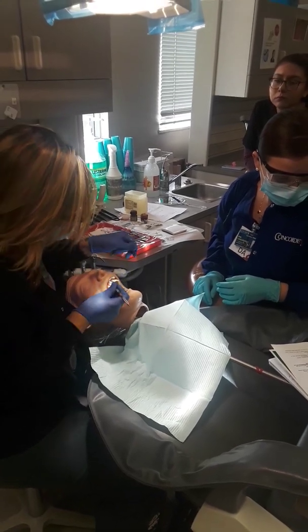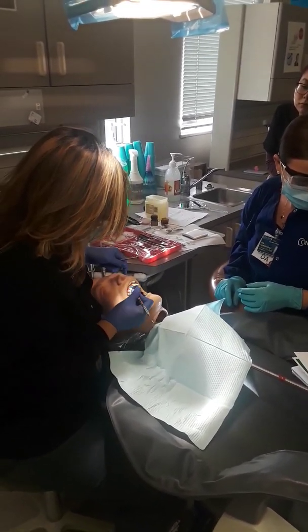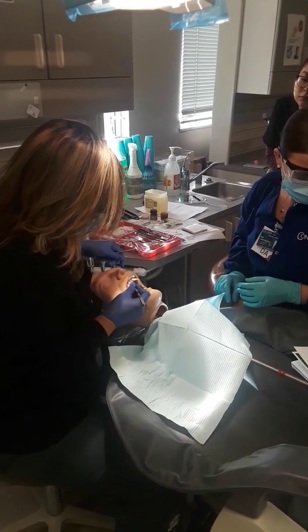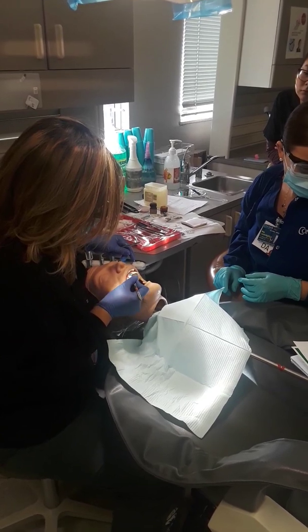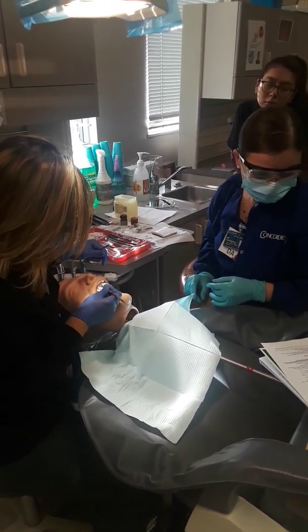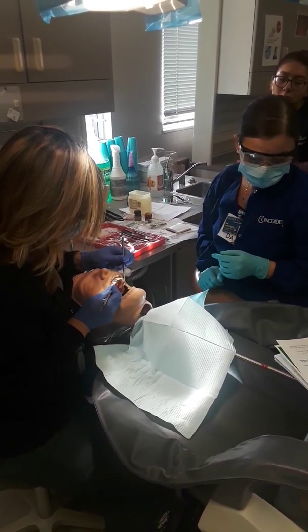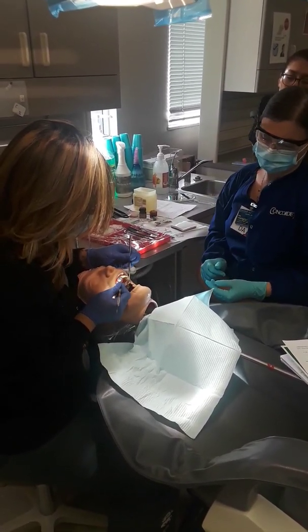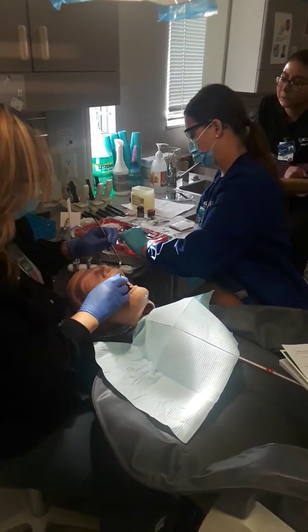Sorry, I didn't clean up my patient. There's a little bit of material in his gums. There we go. Any material in the gums is going to make those gums hurt or tooth hurt. Could cause an infection, so make sure you clean up your patient. Okay, ready when you are.